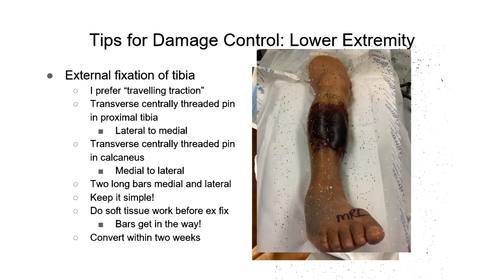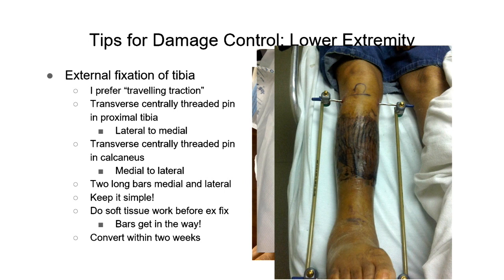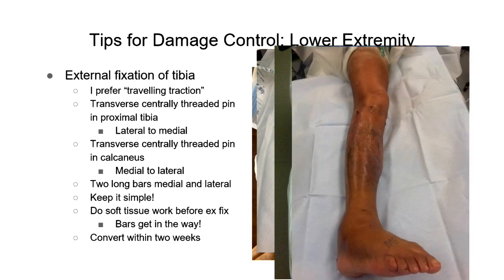We ended up putting her into traveling traction, transverse pin up top, transverse pin down below in the calcaneus. It all defervesces. I don't routinely unroof the blisters. That's a whole other conversation. And then she came back within 2 weeks, and skin looked great, and we ended up putting a nail in.